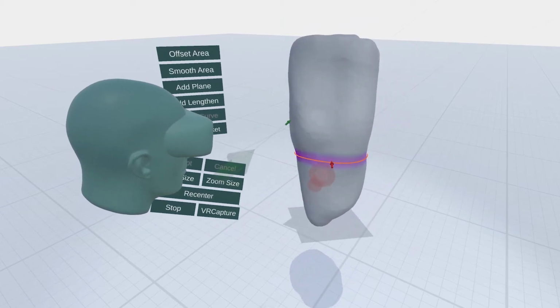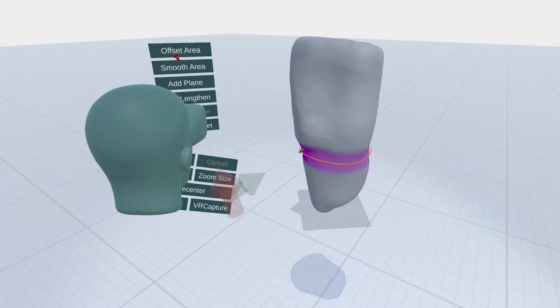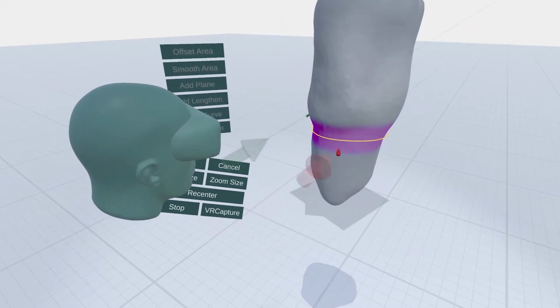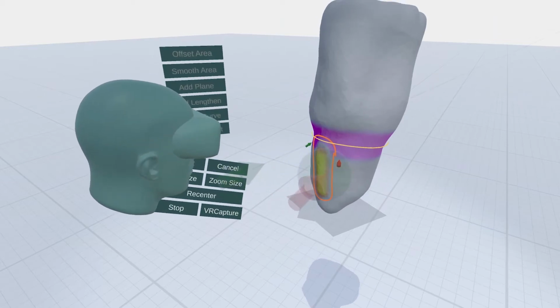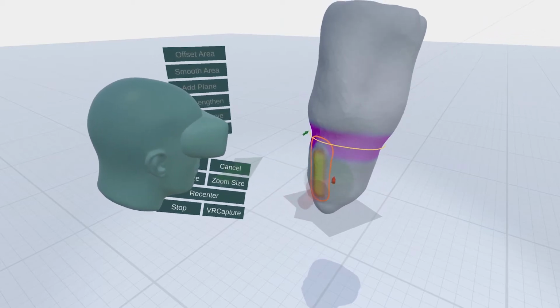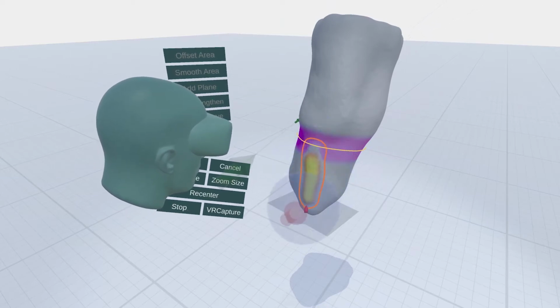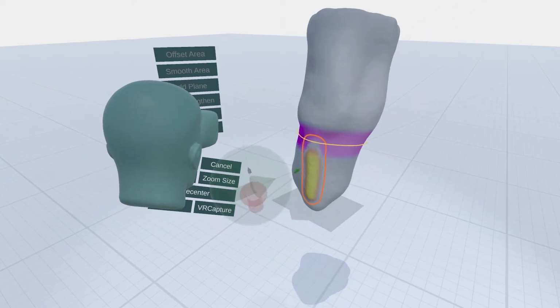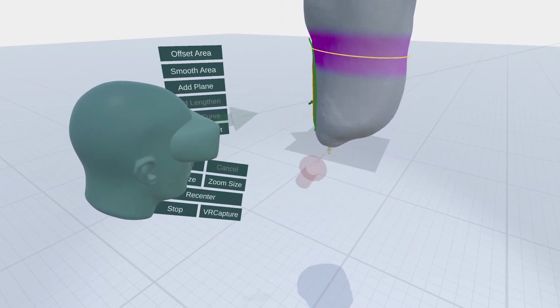Once the scan is aligned, we move on to what is called rectification. In this step, the prosthetist modifies the shape of the scan so that it will be more comfortable and safe to wear. In some areas, material is removed so that the limb is slightly compressed. Because the limb changes shape as the wearer moves, other areas of the scan are enlarged to make room for muscles and bones. The prosthetist uses several different 3D tools to make these shape changes.